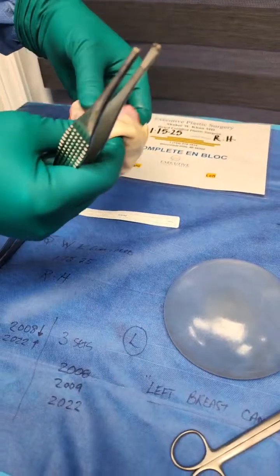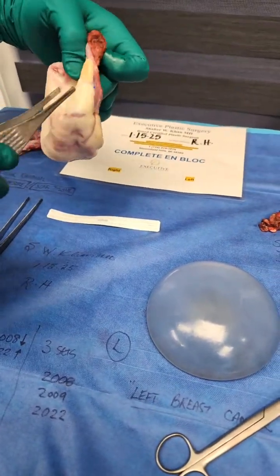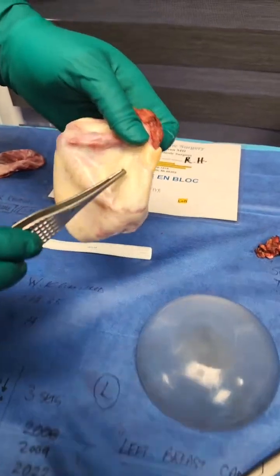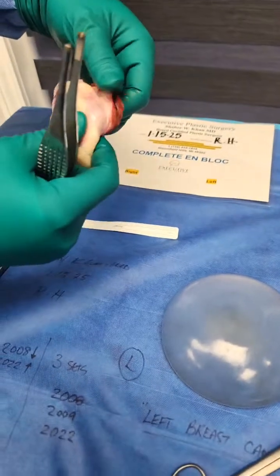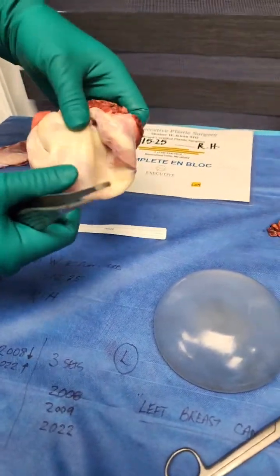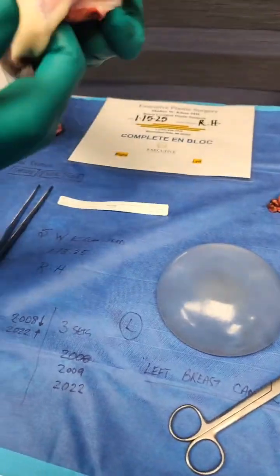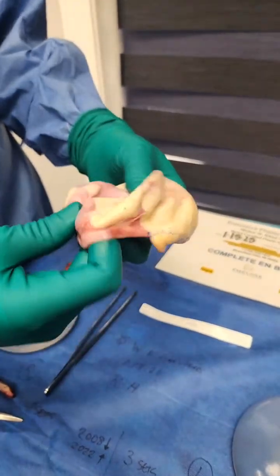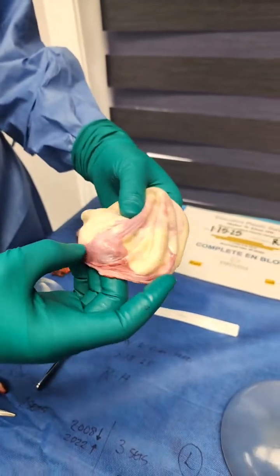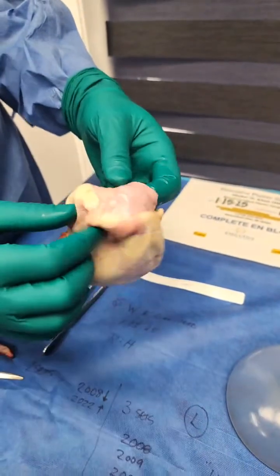A lot of this is cadaveric skin from another patient that was processed. You can actually even see the hair follicle areas where the hair comes out from on the skin. And this is a lot of alloderm. The alloderm is the whole capsule, if you will. Extensive amounts of it. So you can see this rectangular band right here.